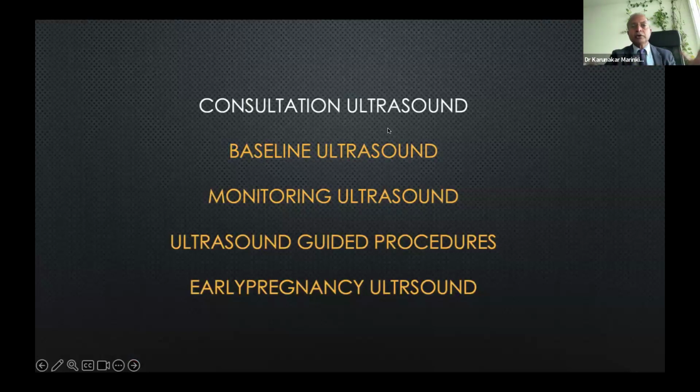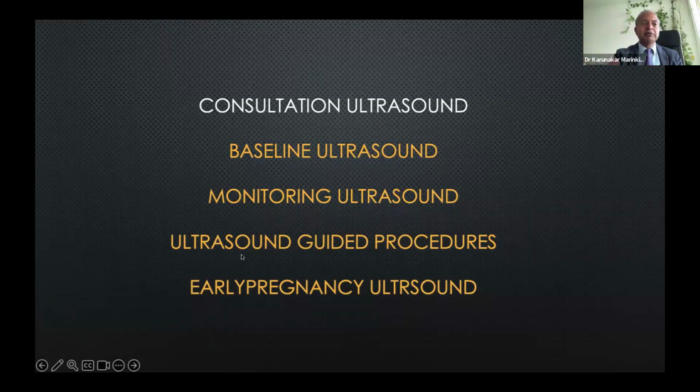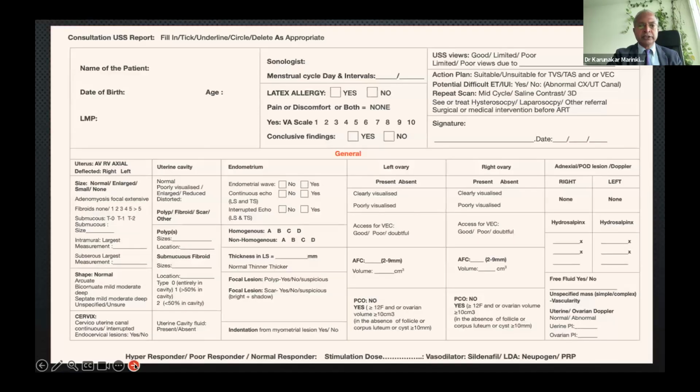So ultrasound will be spread out: consultation ultrasound, baseline ultrasound, monitoring ultrasound, ultrasound-guided procedures, and ultrasound in early pregnancy, because patients expect us, as IVF clinicians or primary, secondary or tertiary care providers of infertility services, to at least give a clean sheet that pregnancy is there, pregnancy of unknown location is there, ectopic is there, or miscarriage is there, only then to discharge to an obstetrician. It may well be that you are the same obstetrician who will be delivering, but you need to classify the role of ultrasound in all this.